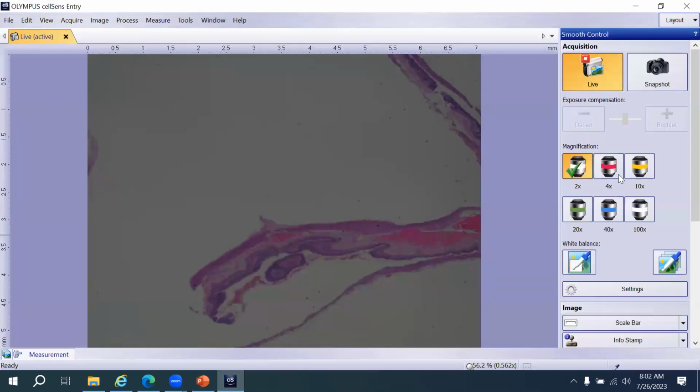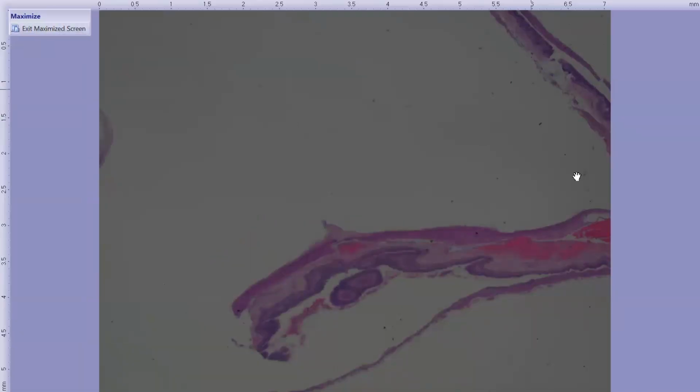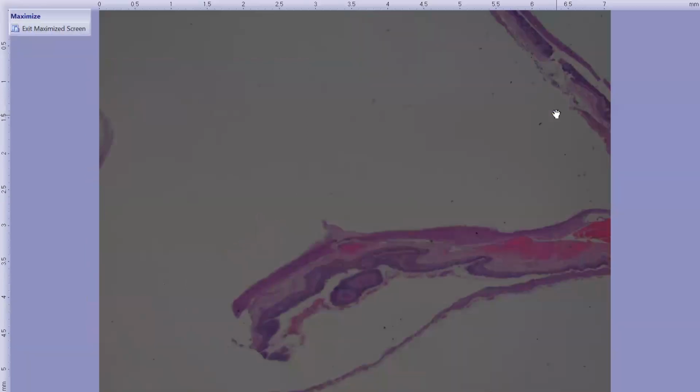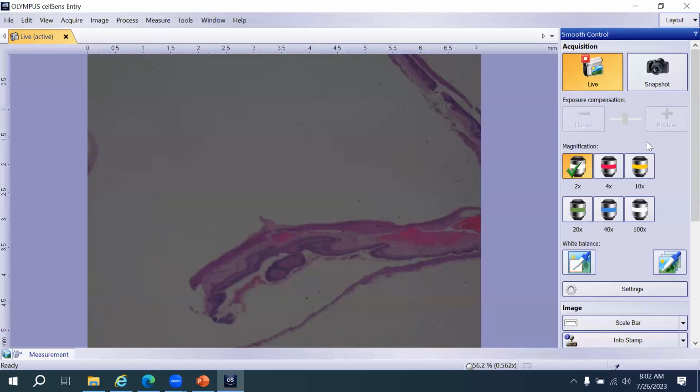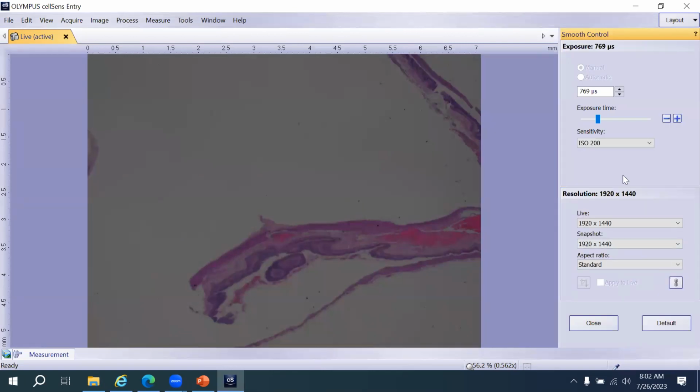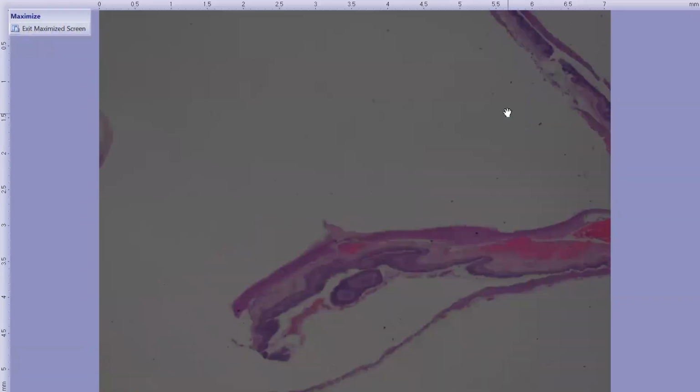So here we go. I tried to white balance it earlier and it didn't do a whole lot. Looks like the auto response or it's set to increased contrast. And I don't know how to do any of that. You started a bit simple. Yeah. All right. Well, we're just going to go with this because that's what we have. All right.